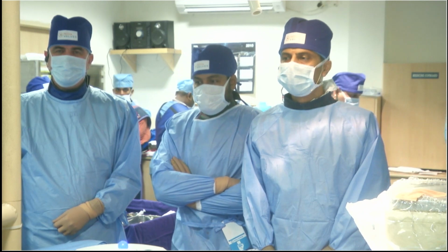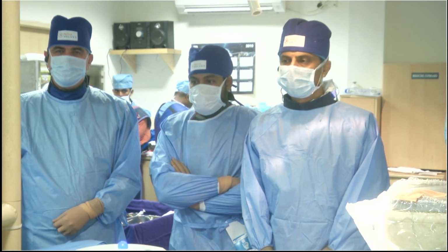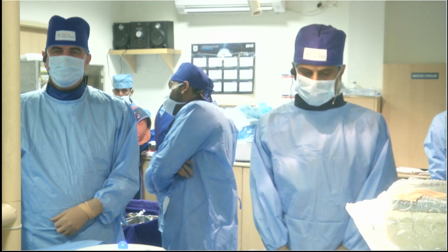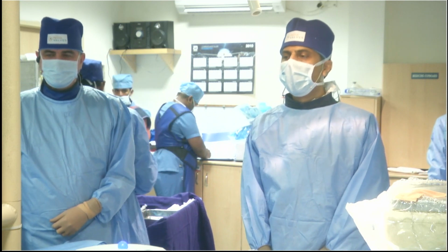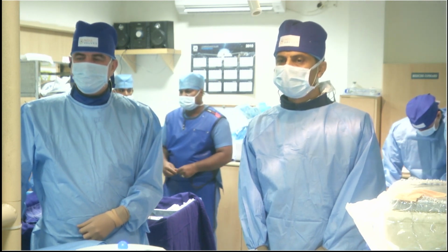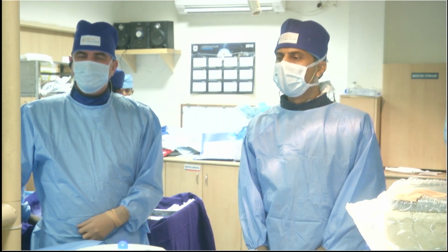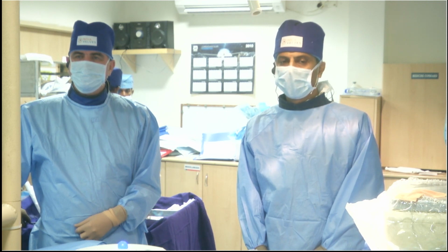Welcome to this session. It's a joint session between EuroPCR and India Valve. I think Kantaro has a long experience with this in Japan, and this is a special session which is a learning live. You will see a live case, and we'll be able to discuss along the case for each step what is good, what is not good, what should we do in this particular case. You can discuss, we can ask any question, and we will move in the room to ask you some questions.